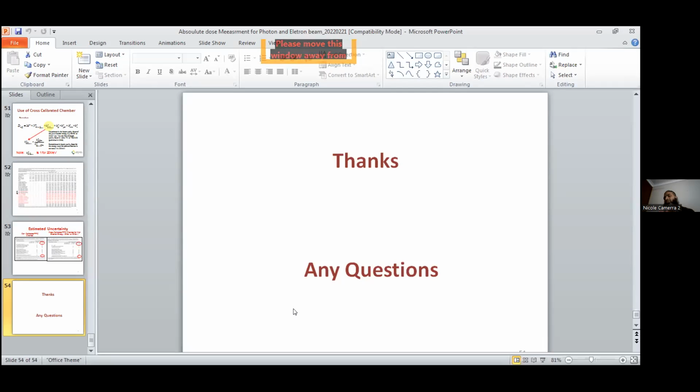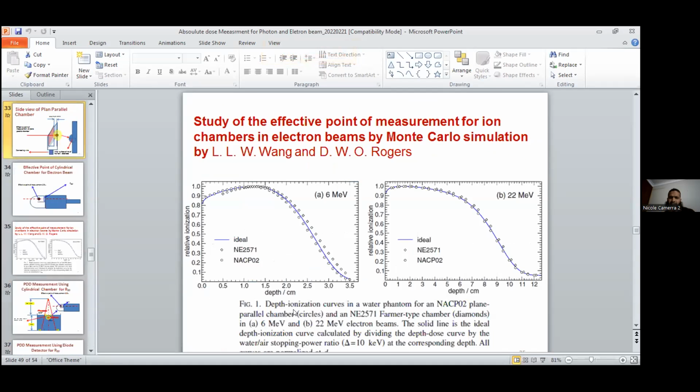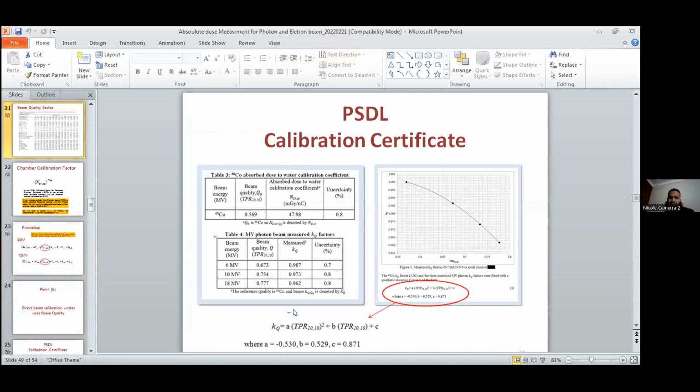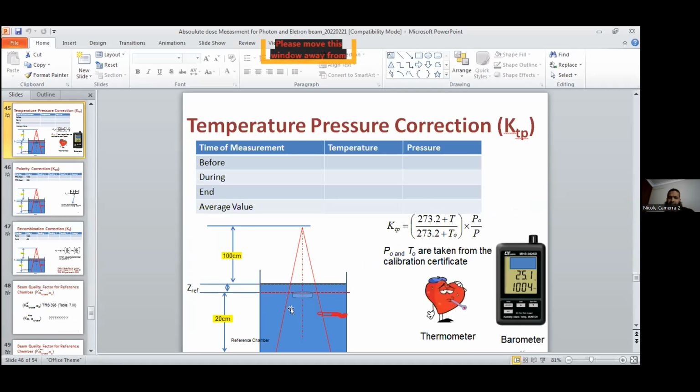Yeah, this is one of the questions which I asked in my presentation. I think the previous presentation I asked it actually, isn't it? So you remember what is the... here they say 273.2, and why we have to correct it for this one. I think you should be answering it actually.